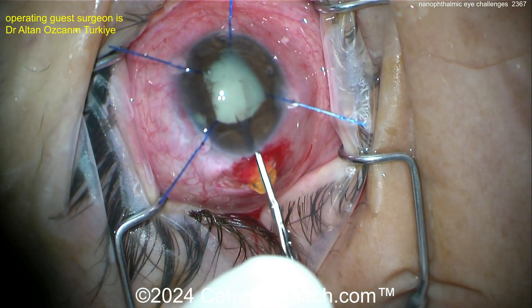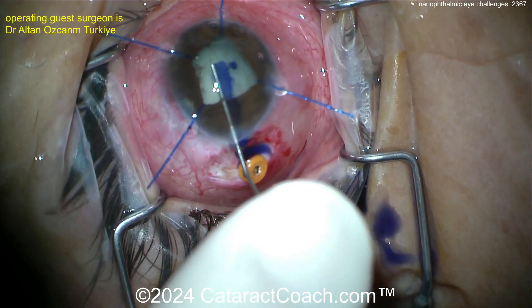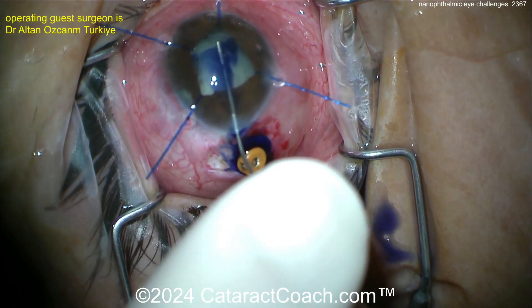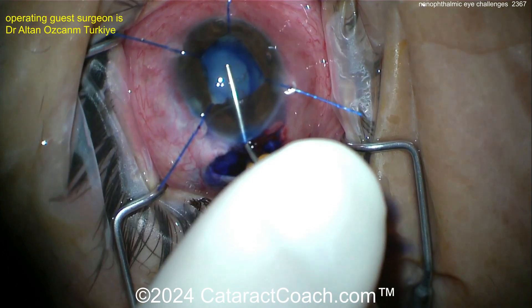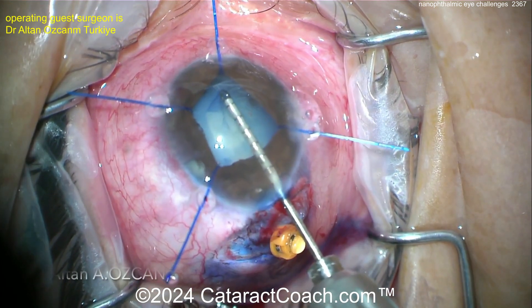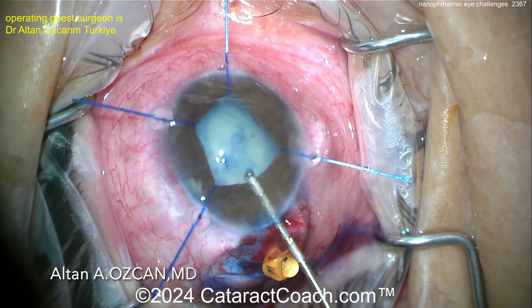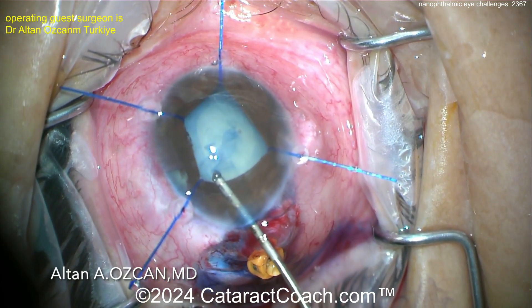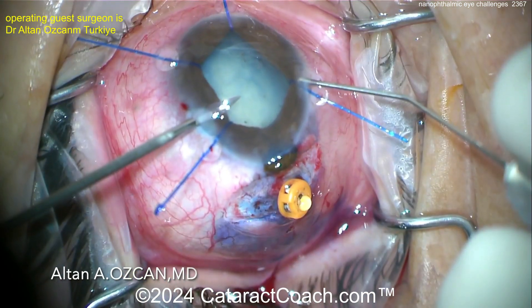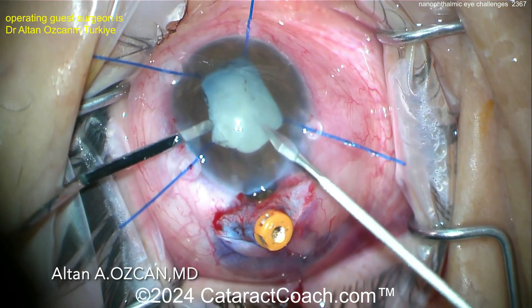Here the capsulorrhexis is being done — not easy. These are my least favorite eyes; I love a big myopic eye with so much room. Because you already have viscoelastic in the eye, you can't fill the whole thing with trypan blue — you have to do a gentle painting. What was done previously wasn't the capsulorrhexis; that was just breaking off some of the synechiae and fibrotic bands. Here you need to get a good-size capsulorrhexis. It's hard to judge because the white-to-white is also very small in this eye.